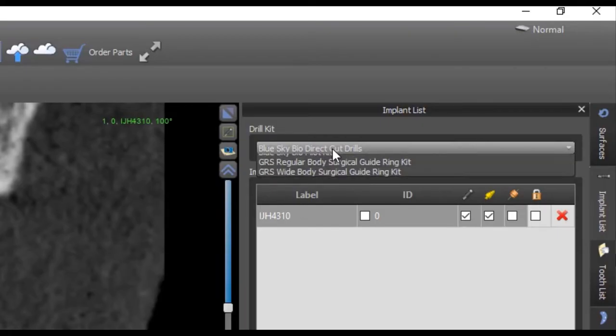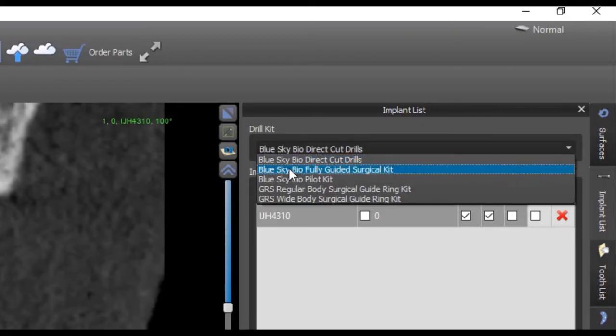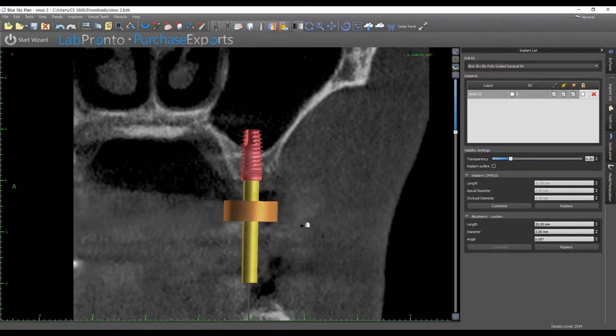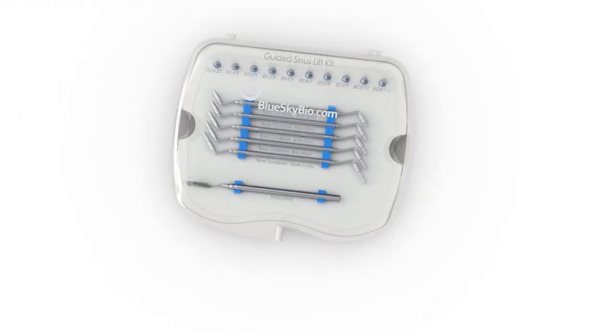The keyless design of these drills matches exactly to the Blue Sky Bio fully guided surgical kit. When using these sinus drills, choose the Blue Sky Bio fully guided surgical kit as your drill kit in the planning software. This will automatically set the guide tube in the correct position for both the fully guided kit and for the guided crestal sinus lift kit.